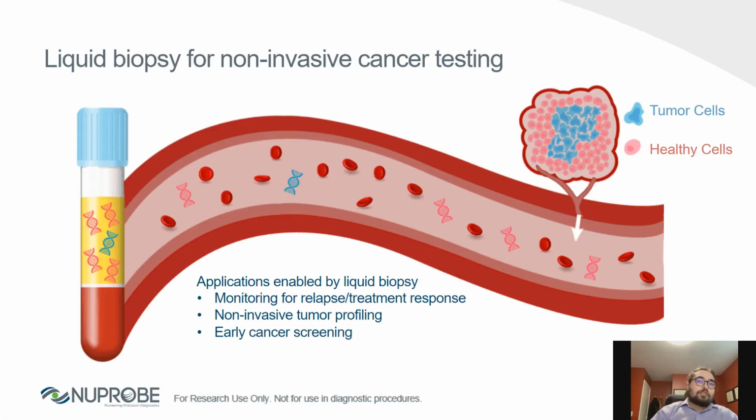Okay, so as you may be aware, the emergence of liquid biopsy has enabled many non-invasive testing options for cancer patients, including recurrence monitoring, non-invasive tumor profiling, and non-invasive therapy selection, as well as early cancer screening.